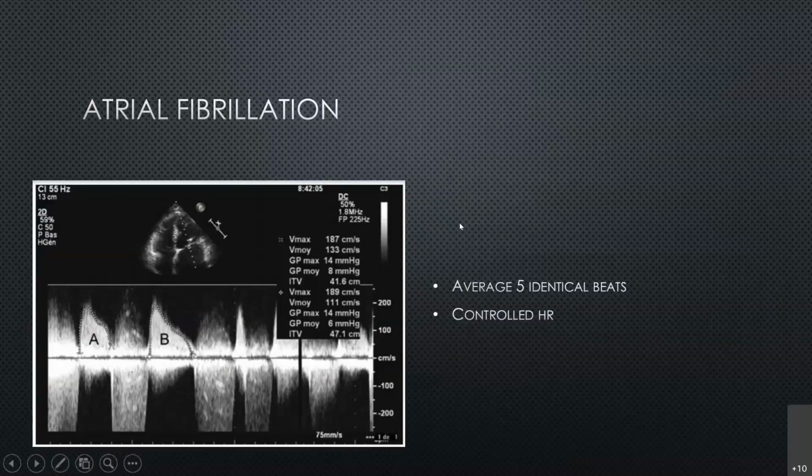No, good points, Geeta. So you have to be very careful with mitral, because a little increase matters. Your velocity is 2.5, so your peak velocities are not going to go more than that. You will never see a peak velocity of 4 meters per second. So being accurate is very important with mitral disease.